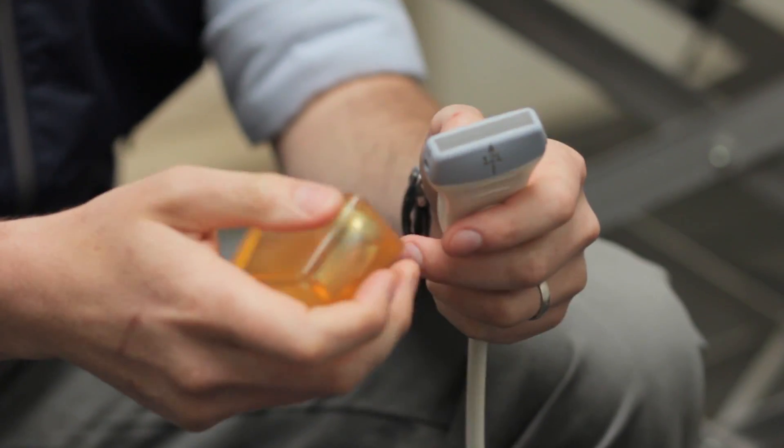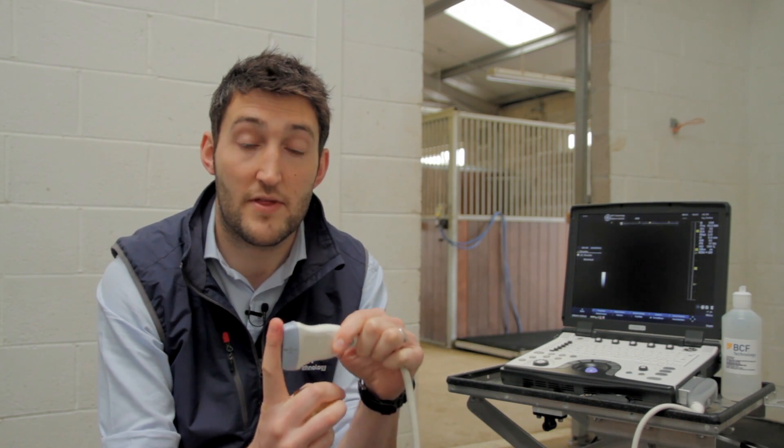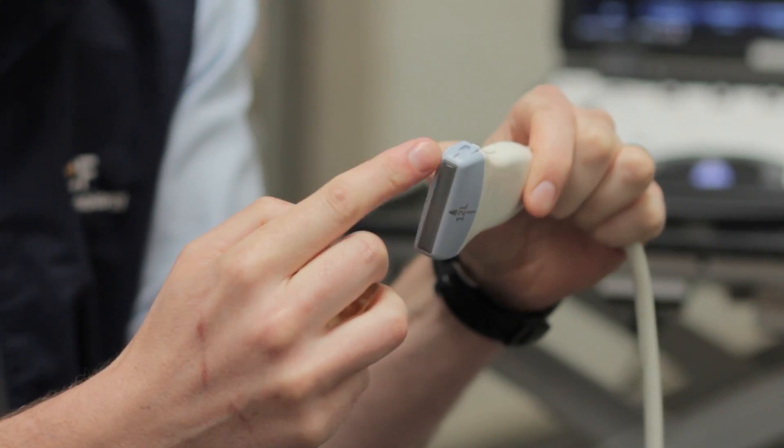The next thing to consider is what type of probe you want to be using. For scanning tendons and the distal limb you're going to need a linear probe — one that looks like this, with a nice flat long surface. This enables you to get cross-sectional images, and it's also very helpful for the longitudinal images when scanning along the length of the tendon fibres, because all of the fibres are then parallel to the surface of the transducer. If you've got a probe with a curved end, you'll find that makes those longitudinal images much harder. These probes also tend to be the highest resolution, giving the best image quality of the tendons, with a depth of penetration well within the five to six centimetre range we need.